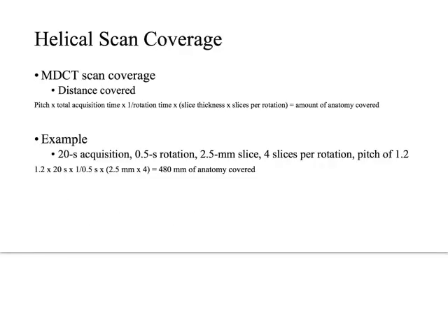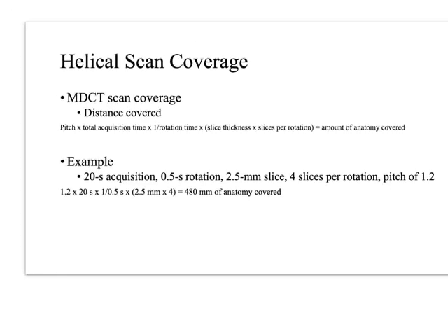The final piece in this puzzle, and one of the big takeaways for us today, is figuring out helical scan coverage. So now that I know I have the ability to move the table quicker than the slice thickness, I need to be able to figure out what's the area that I've covered with the CT scan.